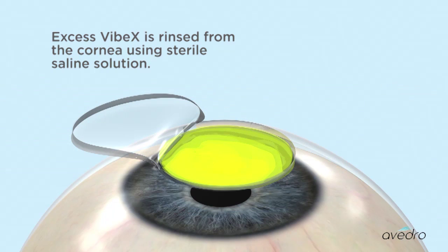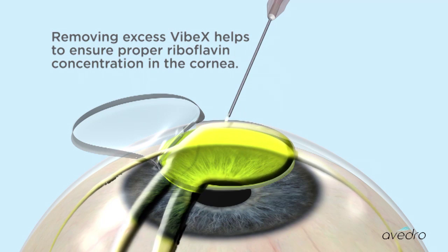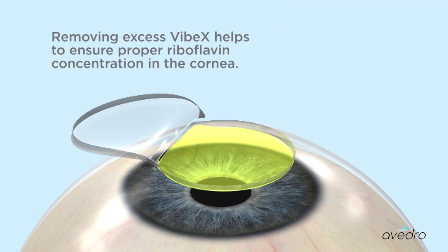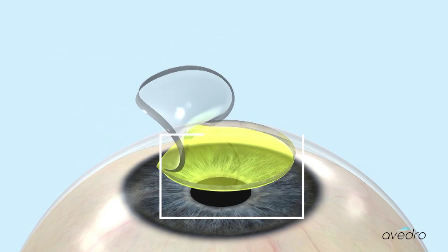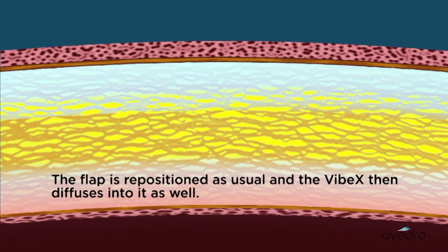Excess Vibex is rinsed from the cornea using sterile saline solution. Removing excess Vibex helps to ensure proper riboflavin concentration in the cornea. The flap is repositioned as usual, and the Vibex then diffuses into it as well.